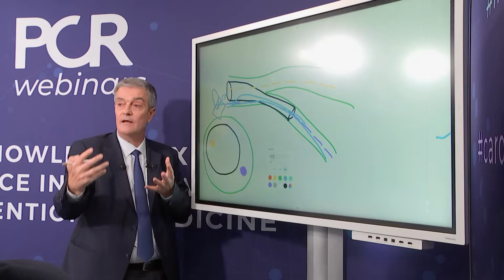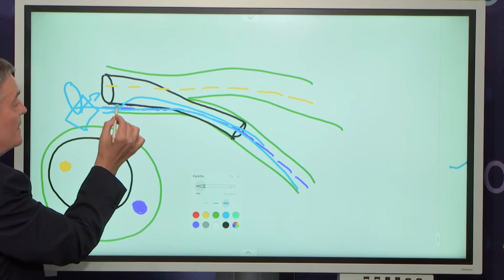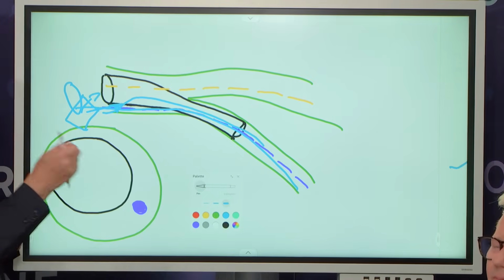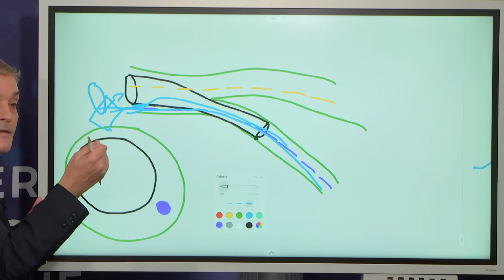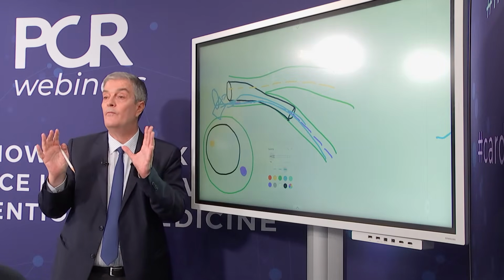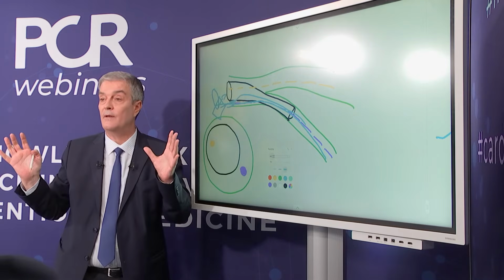So these are two pitfalls that I tried to illustrate using figures from our consensus. They will help you understand that if you have a device that gets stuck, blocked at the proximal edge of the stent at the ostium of the left main, one possible explanation is that you don't have full expansion and deployment at the ostium.